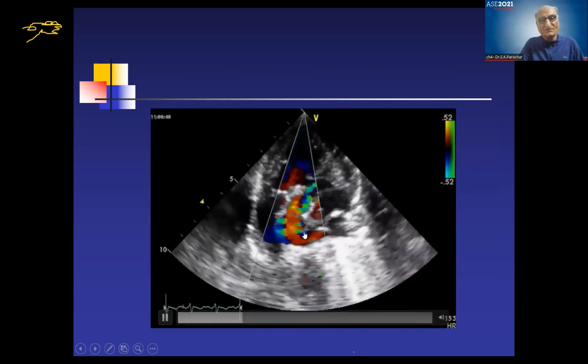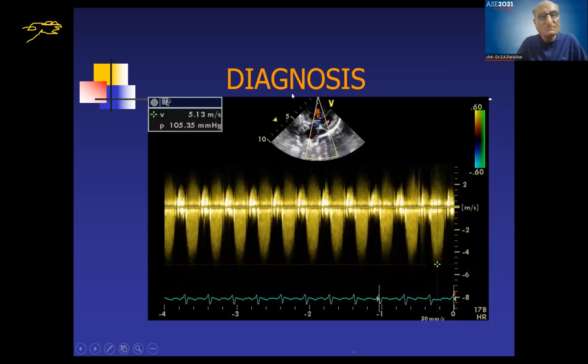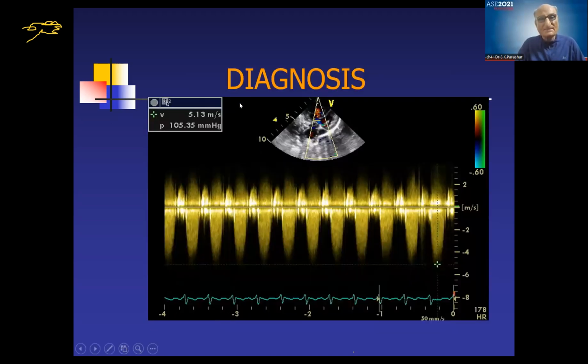So that means the other artery, which was coming from the right ventricle, was the aorta, and this is the pulmonary artery coming from the left ventricle, and it shows a bifurcation. One goes here, one goes there. And you see, when you put a CW Doppler, there is a severe pulmonary stenosis. As you can see, there's turbulence also. We put a CW here, and there was severe pulmonary stenosis with a velocity and gradient of about 105 or so. So this gives us the diagnosis.